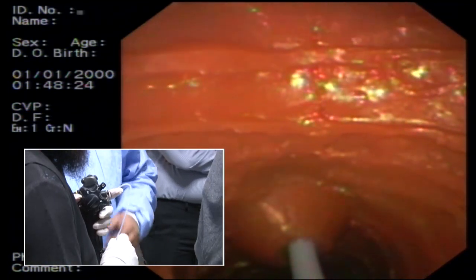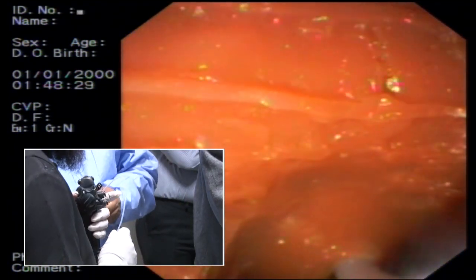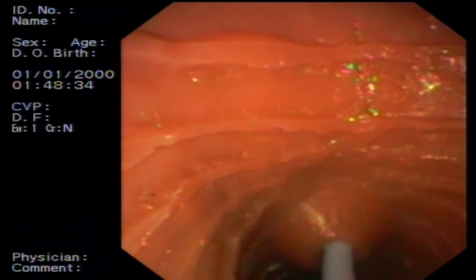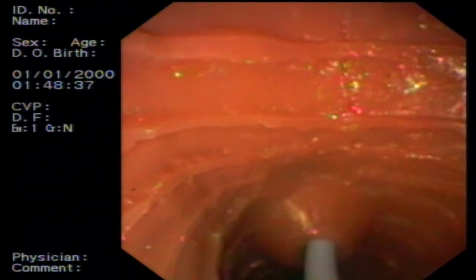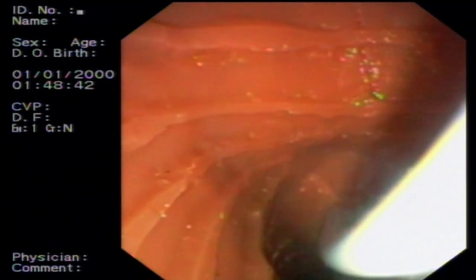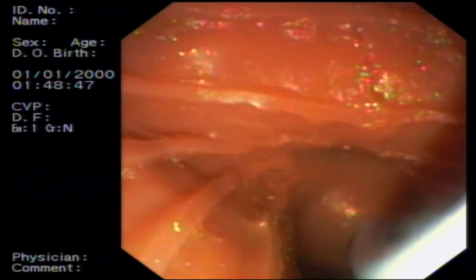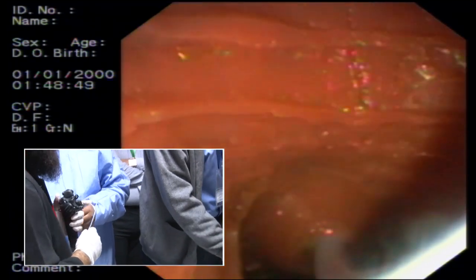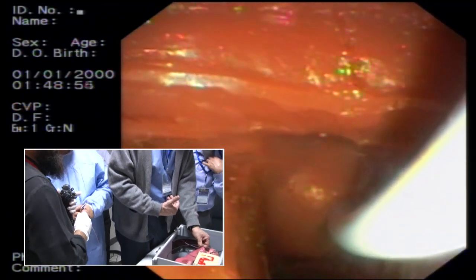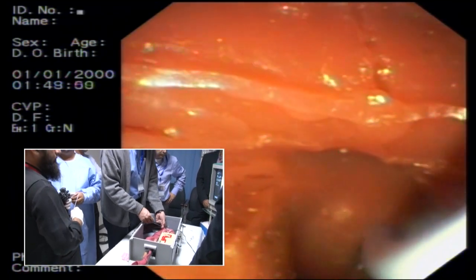What is happening is because after this, this is not being pulled back. Let me just pull this a little bit more. Now, यहाँ पे elevator को use कर रहे हैं. अगर इस position में आ जाए ना stent बहुत ज़्यादा बाहर निकल गया. That's you are putting yourself in trouble. See, what I've done is what I told you. This is what would happen if you pull the scope back. This will bring it close, and then you should be able to cross.